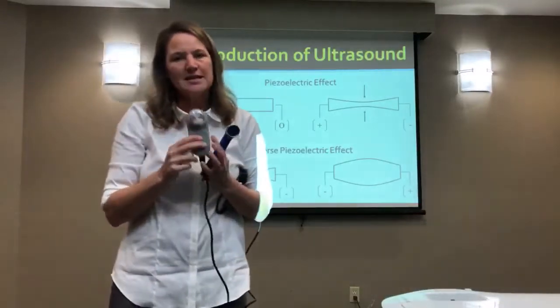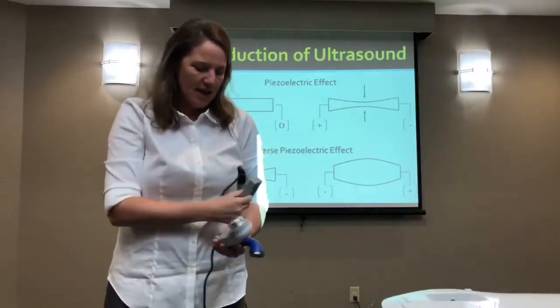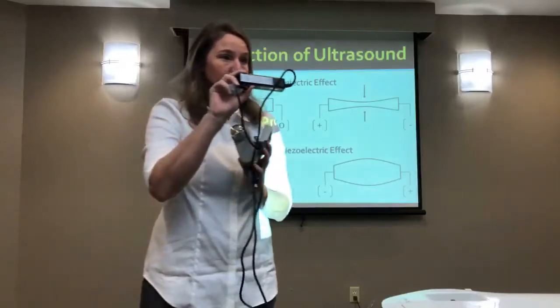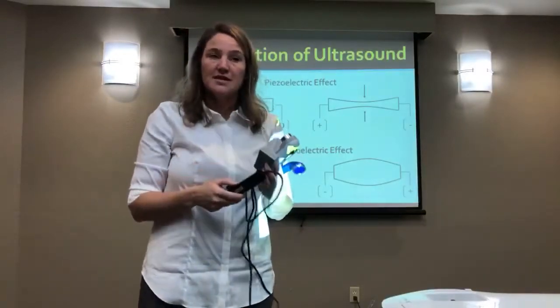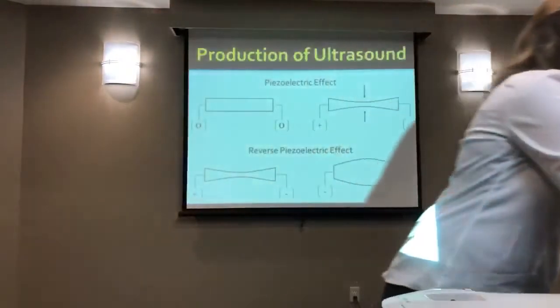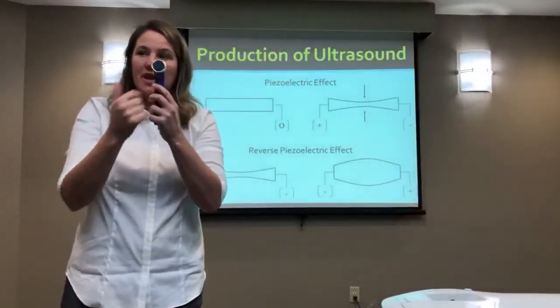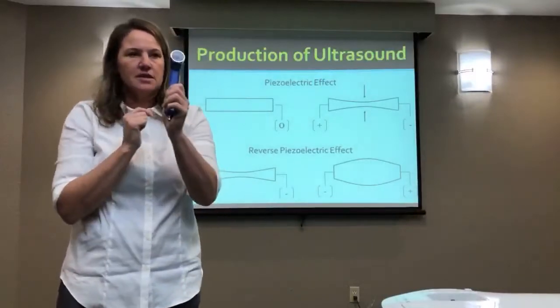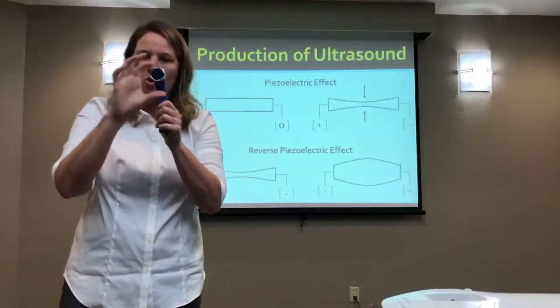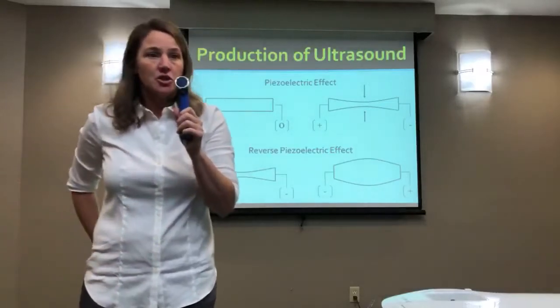The difference here is you can't see it. You don't necessarily know how big your crystal is. So you have to look at the device, and they have to be labeled. This is something that the FDA requires, is they require your devices to be labeled, and it'll tell you essentially how big your crystal is. Most machines, the crystal is pretty much as close as it can be to the head size. This one you can see is almost the entire head. There's a little bit of a mount around the edge, so it's not quite as big as the actual head. And that's the majority of machines that I have ever used, that's how it was.